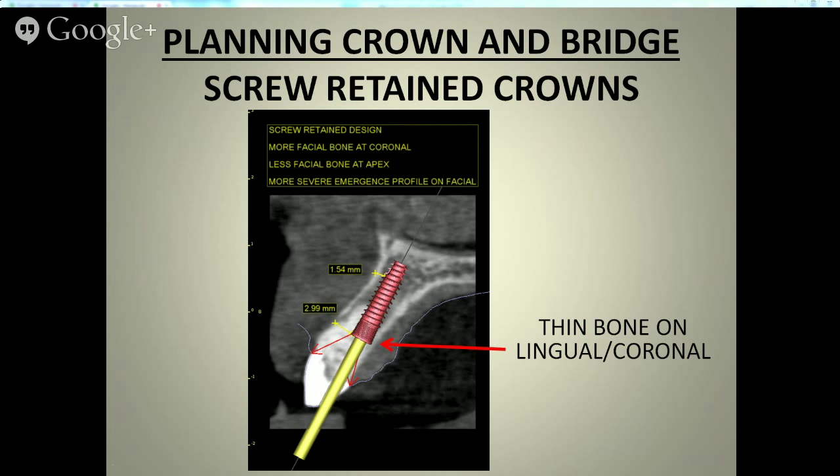You may have difficulty in placing them in the gums and have to do a curettage to allow the crown to seat, or a releasing incision to allow a crown to reseat. And our recommendation at this point, when you know you have this problem, is to have a custom healing abutment made that pretty much forms the sulcus before the crown is made, so that when we take our final impression, the sulcus is there, and we simply have to make the abutment and fill the sulcus with porcelain as it was shaped with the provisional or custom healing abutment. That can be an entire subject almost for a subsequent lecture.